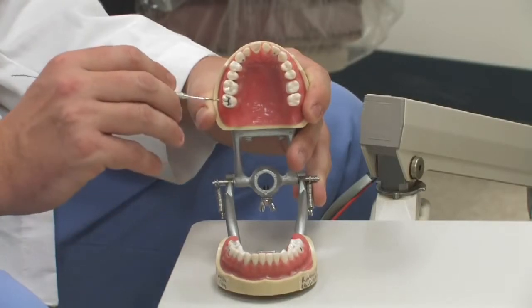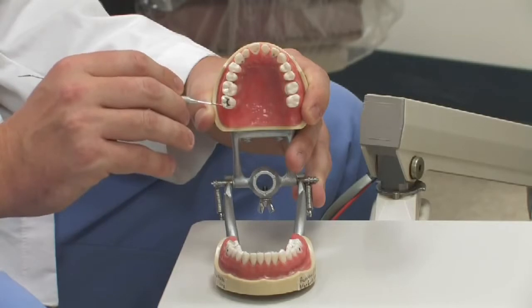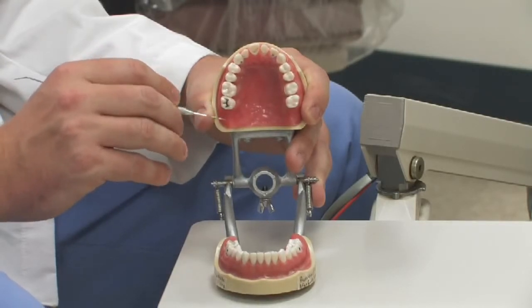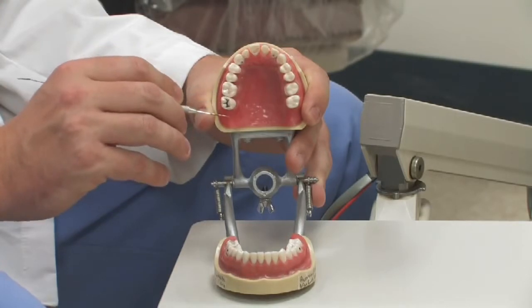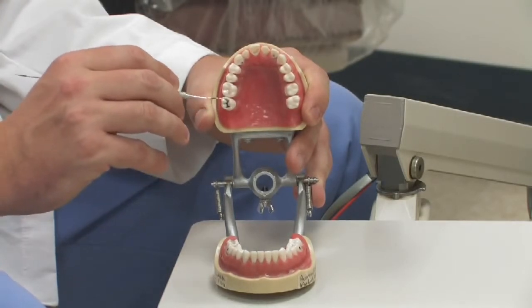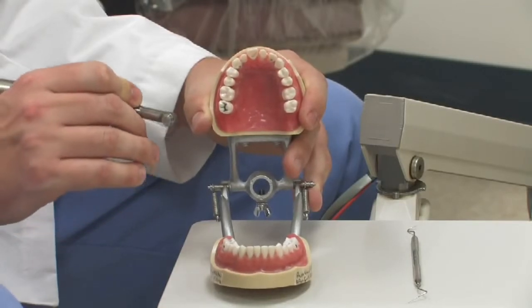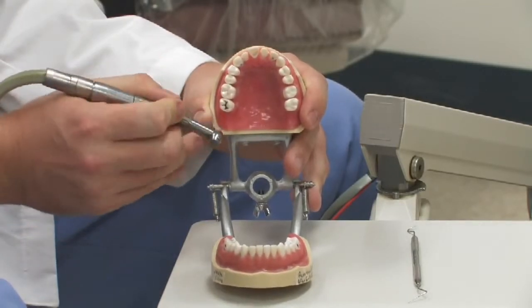So the first step in doing a filling is going in and numbing up, or anesthetizing, the patient. We do this in order to make the patient very comfortable so that when we remove the cavity, it does not cause any irritation or annoyance to the patient. We'll take what we call our handpiece and go in there and lightly clean out the cavity like so.